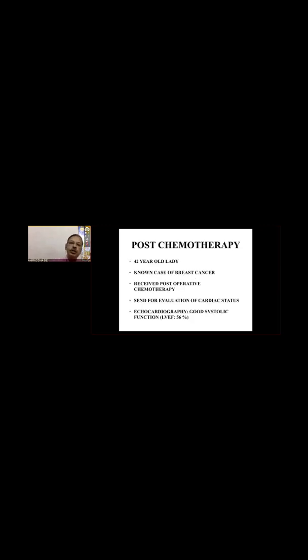If GLS is reduced by more than 15%, suppose you don't have the baseline one, during chemotherapy, it is regarded as evidence of cardiotoxicity, where beta blockers are supposed to protect against CTRCD in patients with a significant reduction of GLS during treatment. I'll give a story of a particular lady, a 42-year-old lady, a known case of breast cancer, who received post-operative chemotherapy and was sent for evaluation of cardiac status.